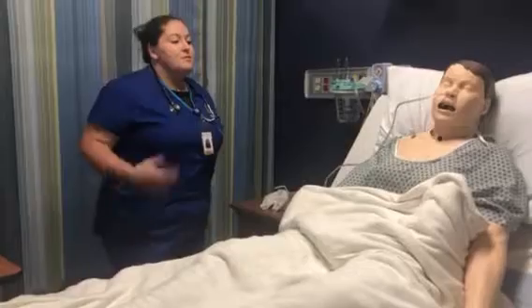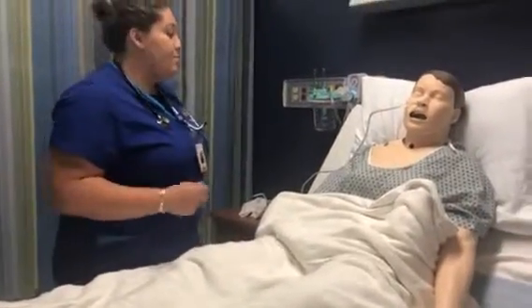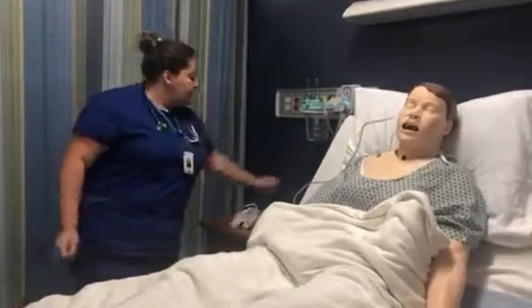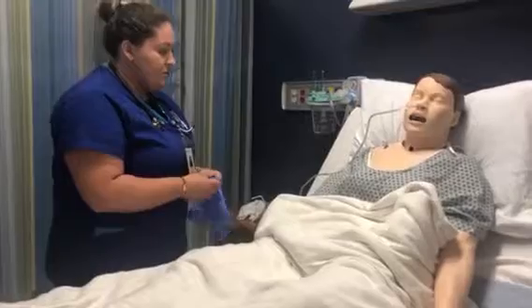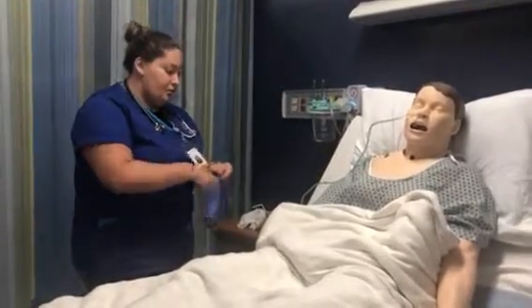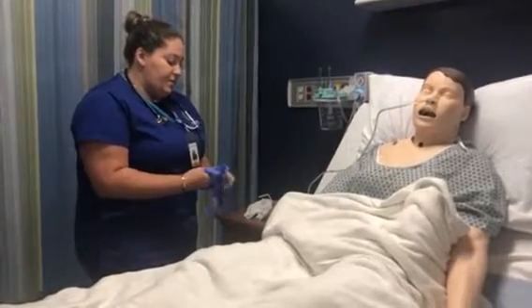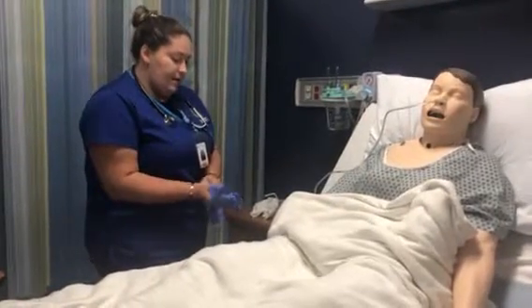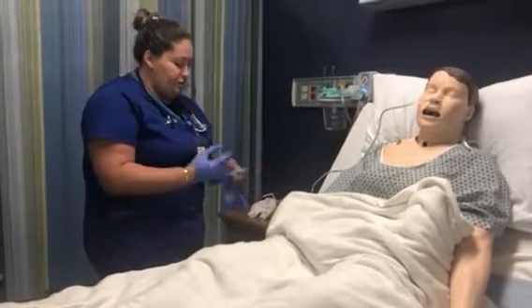All right, so now this would be the next day. I would come in, perform hand hygiene, put on clean gloves. Hi, Mr. Smith. So we noticed that you're able to properly feed now, and we're just going to remove the NG tube. Is that okay? You may feel a little bit of discomfort. If you can, just hold your breath while I'm going to remove the tube.